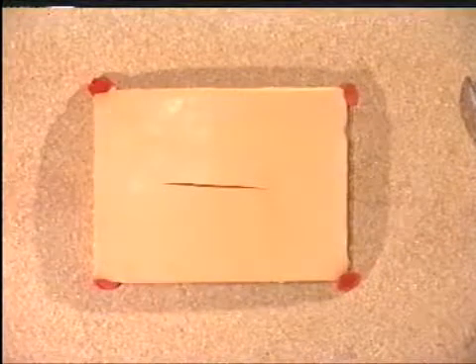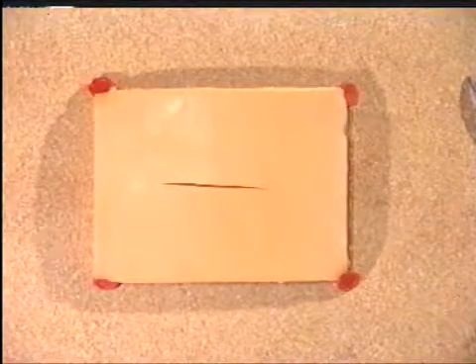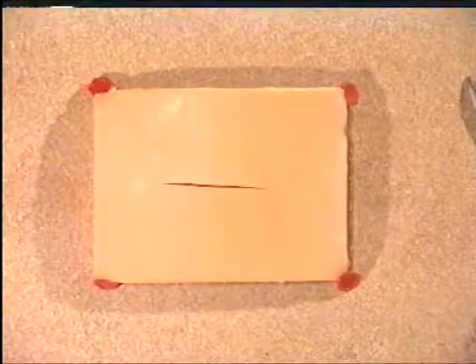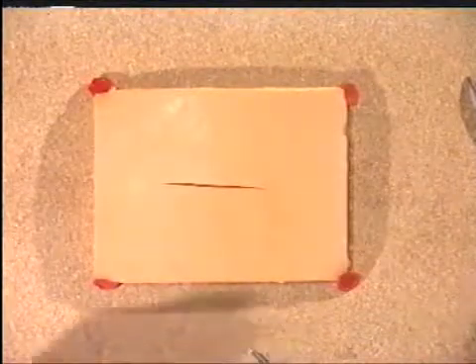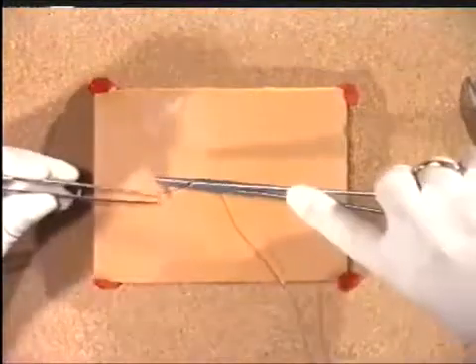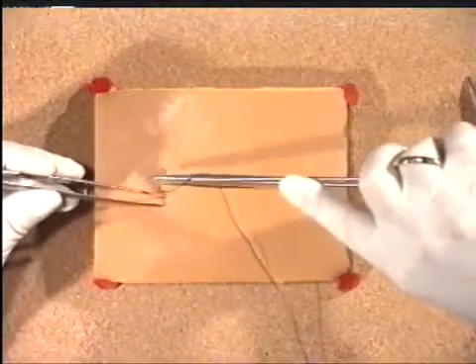We will now demonstrate the essential role of the assistant in the insertion of a continuous suture. Start once again by inserting the initial suture and ligating this using the reef knot technique.